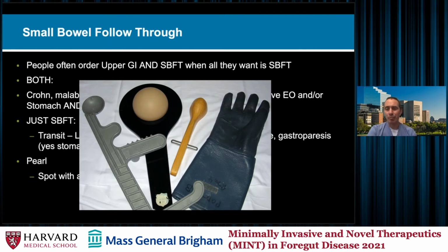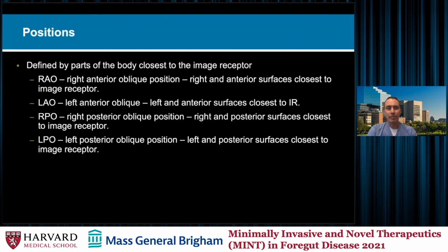The reason I don't want it on the patient is that anything super dense means the detector has to use more radiation, and that's a terrible idea. You don't want to do that. So we don't. All right.